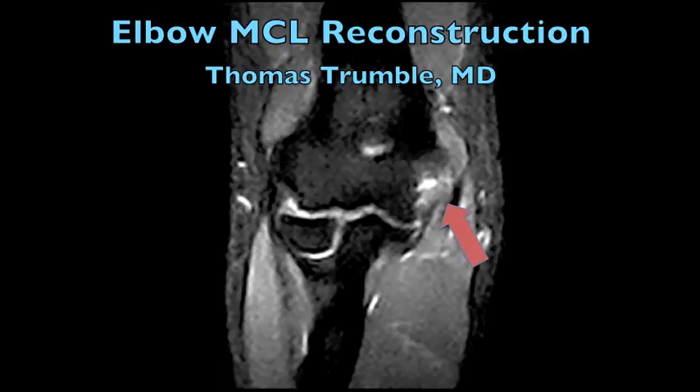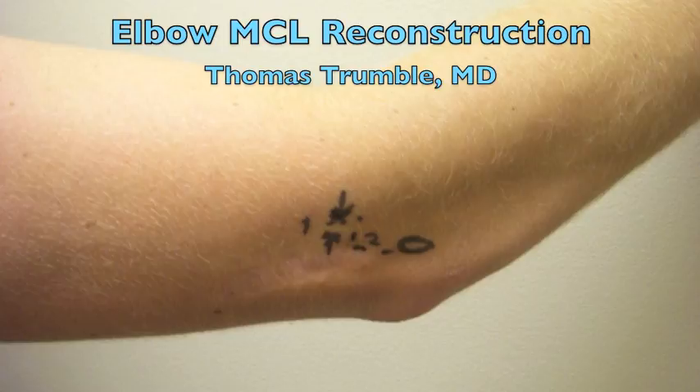Reconstruction of the elbow medial collateral ligament in the setting of a patient with a flexion contracture with fibrosis of the anterior capsule.